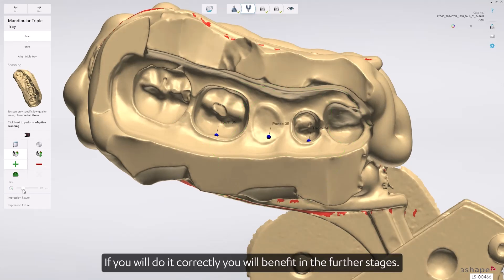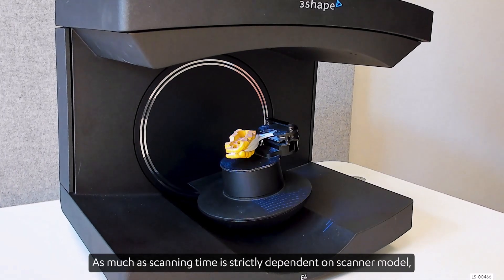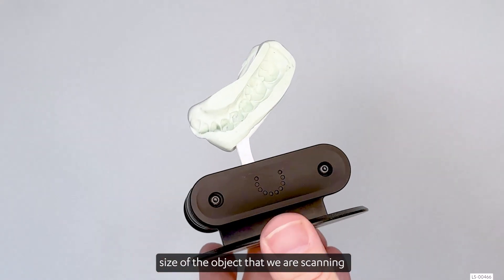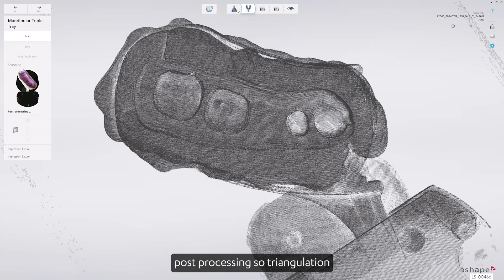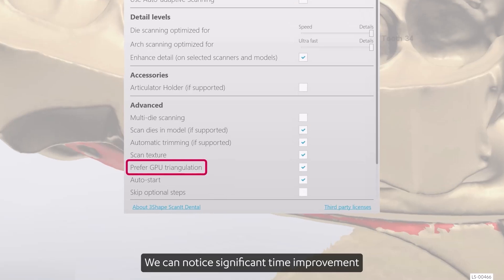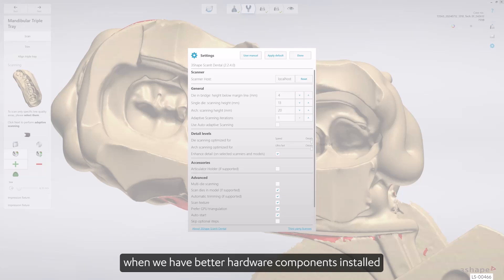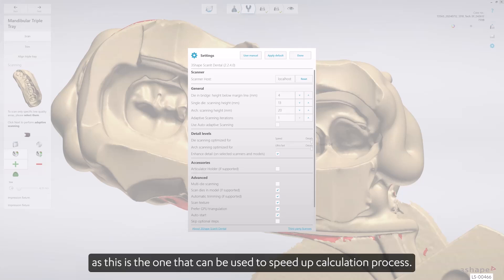If you do it correctly, you will benefit in the further stages. Scanning time is strictly dependent on the scanner model, the size of the object being scanned, and the detail level required. Post-processing — so triangulation — depends on computer hardware components. We can notice significant time improvement on triangulation or post-processing when we have better hardware components installed, as well as a good graphics card, as this can be used to speed up the calculation process.